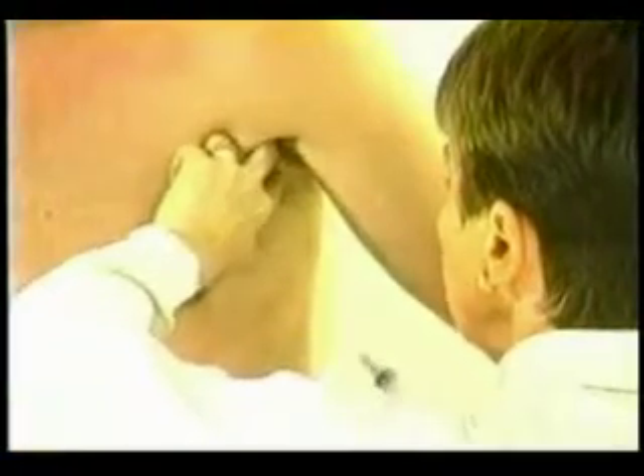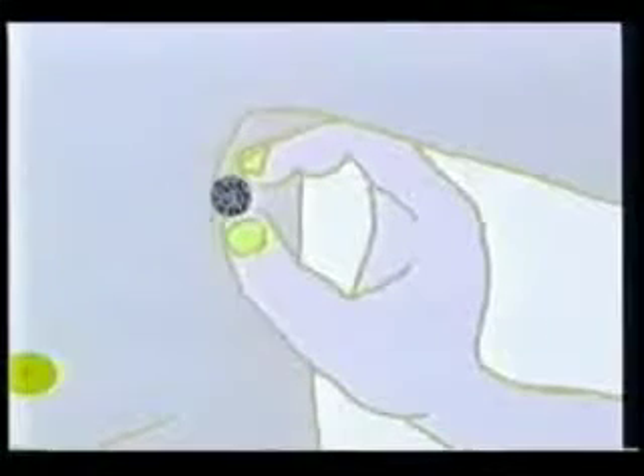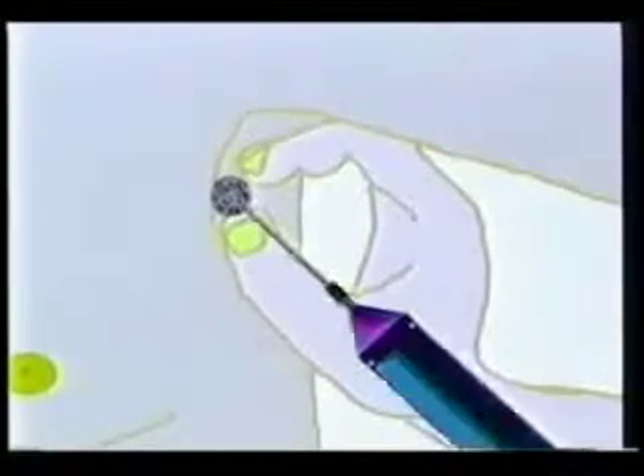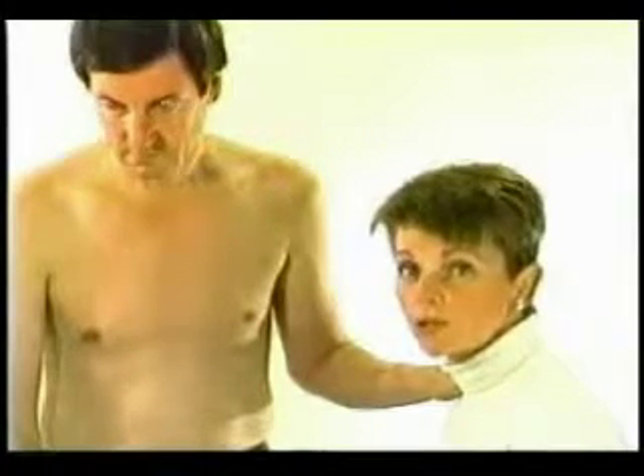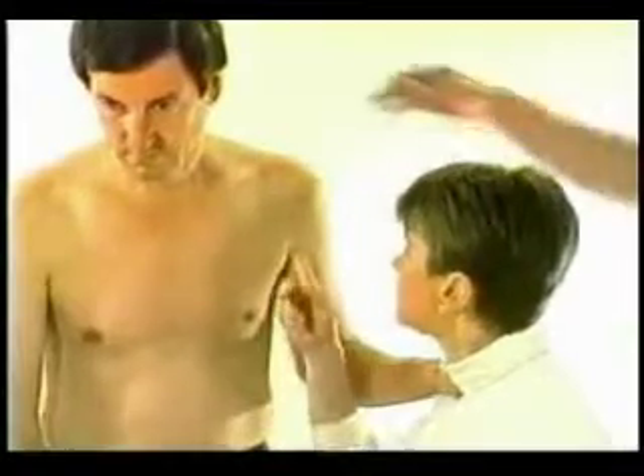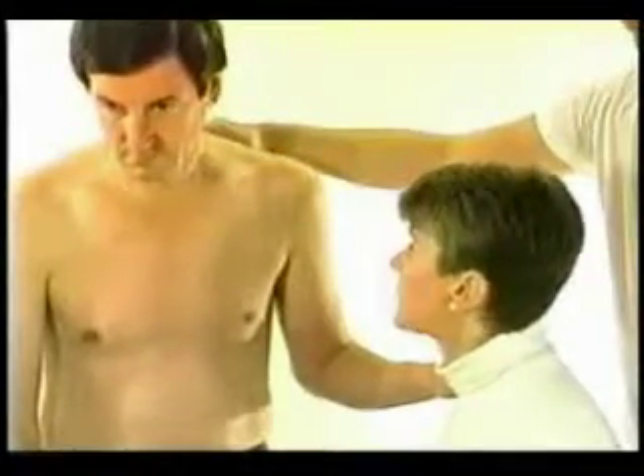With the patient in this position, it is possible to reach and sample most masses in the axilla. The mass is localized and then trapped against the chest wall with the fore and middle fingers. The thumb of the same hand is used to stretch and flatten the skin below the target to ease access for the needle. Access is made easier by having the operator sitting at a slightly lower level than the patient. It is important that the patient does not move away during the procedure, which can be prevented by giving the patient support in the upper back area.